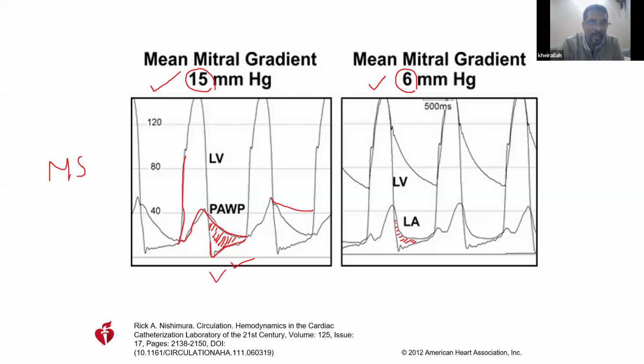What we are measuring on this is non-physiological. Why non-physiological? Because the wedge comes late. So you are supposed to move it a bit backward in your mind. When you move it backward you mitigate this gradient. But it moves forward because it is delayed. When it is physiological, it looks like this, and you notice the gradient is not high. But the wedge, because it is late, looks like this, so there is a big gradient.